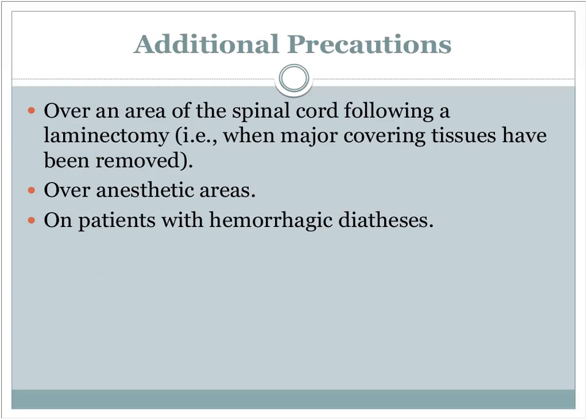Spinal cord after a laminectomy. Well, a laminectomy is a removal of a piece of bone. There is still bone healing that has to occur, so we need to be careful about that. Can you not do it? Well, you can do it, but how long ago was the laminectomy? 2 days ago? I probably wouldn't. 2 months ago? Yeah, you're probably okay.